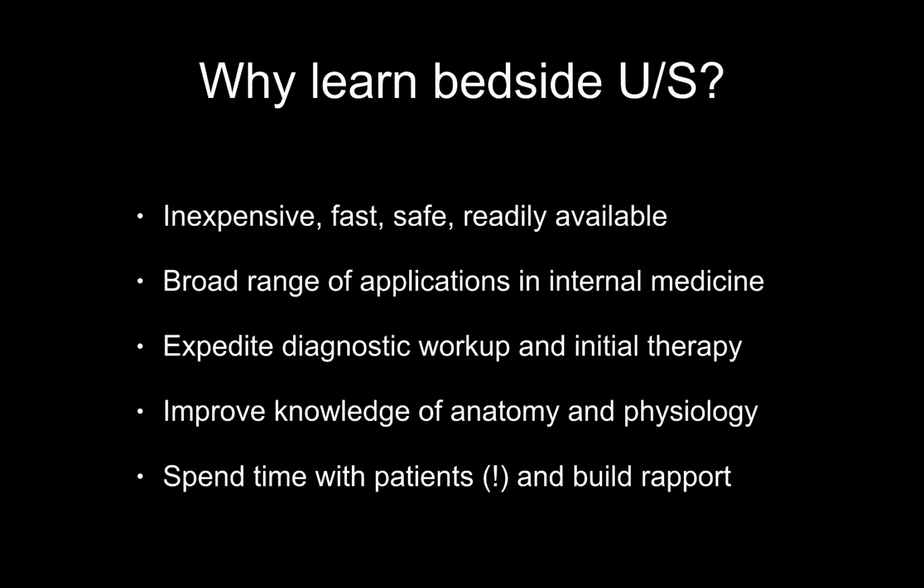Bedside ultrasound can also help us improve our knowledge of anatomy and physiology, especially of the cardiovascular system. And finally, in a time where the constraints of modern medical practice pull us further and further away from patients, bedside ultrasound is just a nice opportunity to spend time with patients and build rapport.